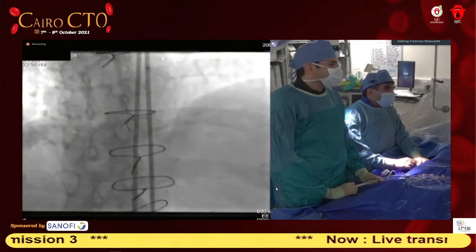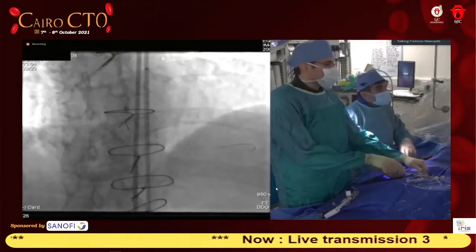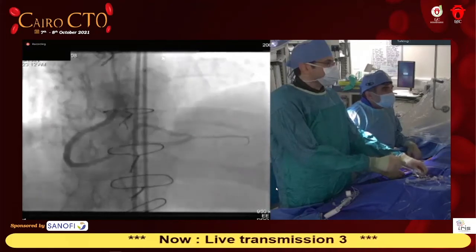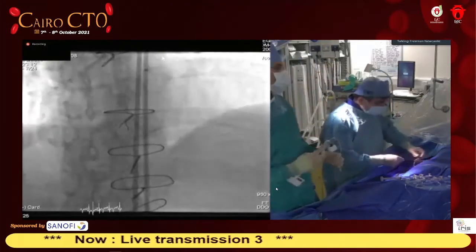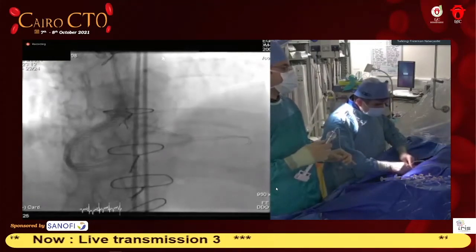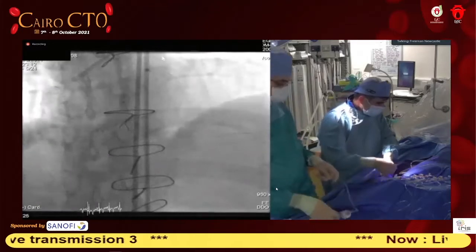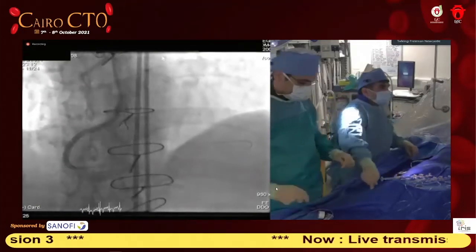I mean, sometimes for the vein graft, I use the vascular plugs, which are much easier, but yeah, great. So we still have one more stent to put in between. You still need two, and then a stent in between. We'll go to coil the vein graft. There is still a stent needed. Yeah, come to LAO.